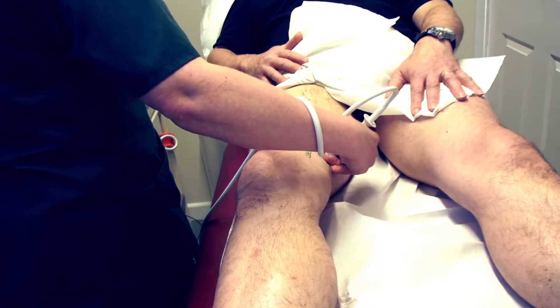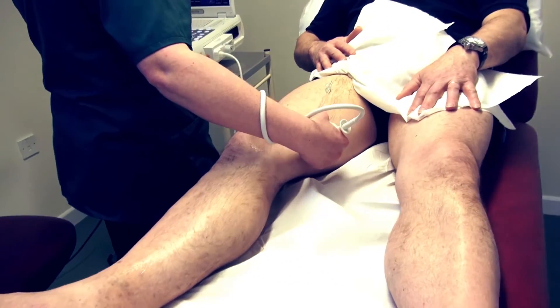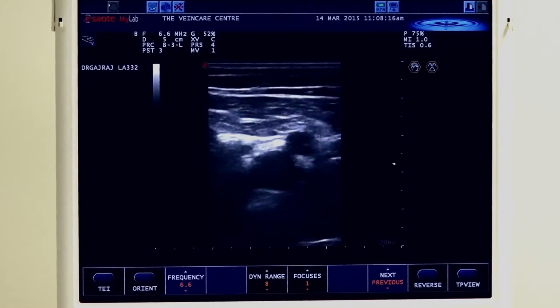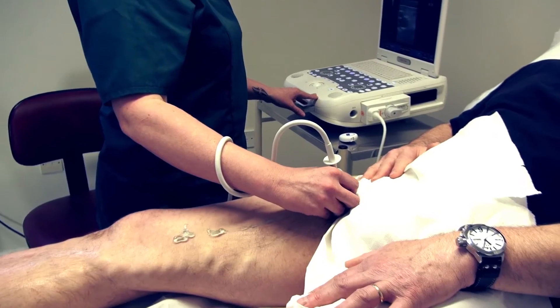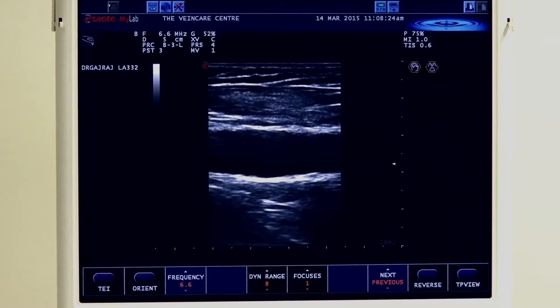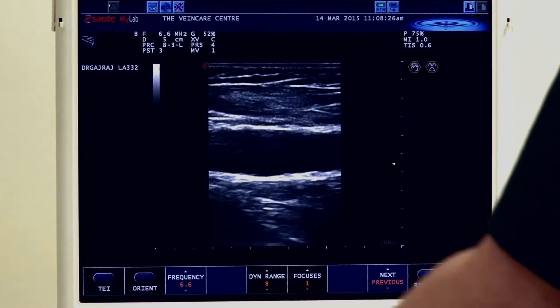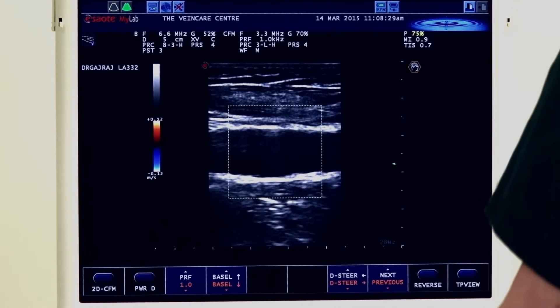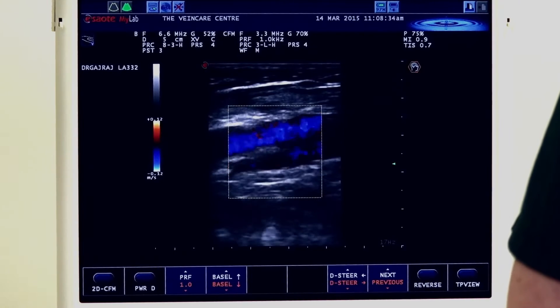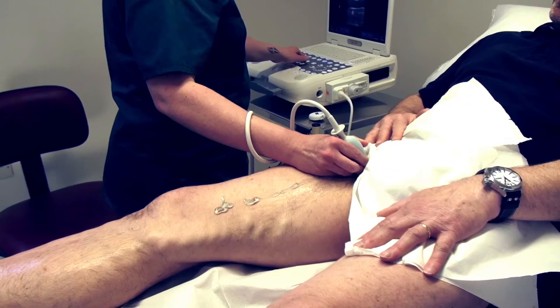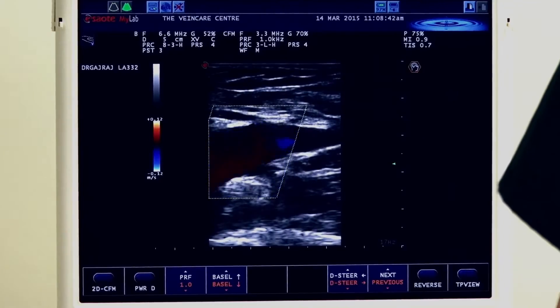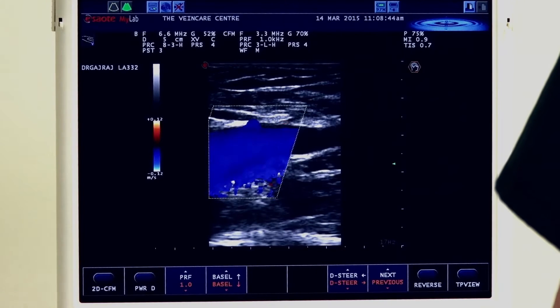Coming down now to the distal femoral vein, and that is compressing beautifully all the way down to the bottom. We go back up to the groin crease and turn our probe 90 degrees into a longitudinal position. We can see that lovely common femoral vein. Using colour flow now — to optimise colour flow, we need to angle our box to pick up the best flow. There is a little artery just flicking in there. By angling the box, we are getting nice vessel flow through the common femoral vein.